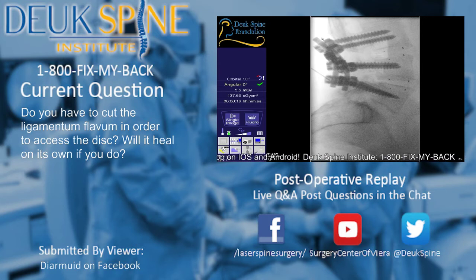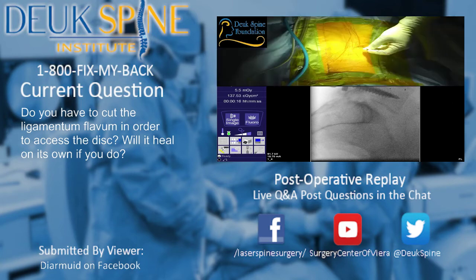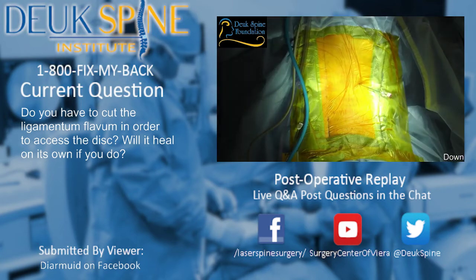We don't even have to really manipulate the nerve root like you do with a microdiscectomy, where you have to retract it medially to be able to get the herniation, and you could injure the nerve while retracting it. You don't have to worry about damaging the nerve root by opening the lamina and doing a laminotomy or a partial facetectomy, where instead of biting bone with your instrument, you can bite the nerve because the nerve is right there and it's very soft.